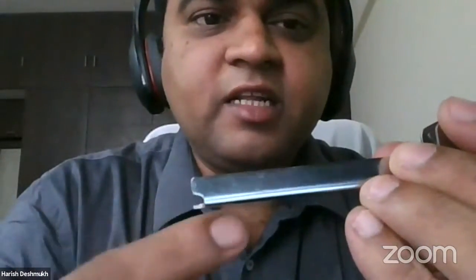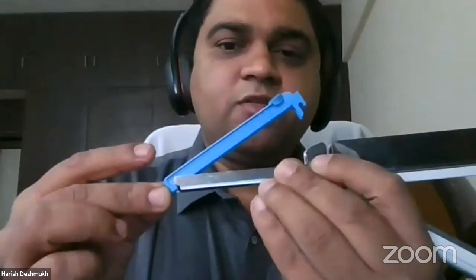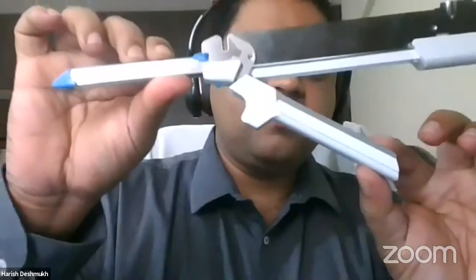If you see here, we have the grooves present, you can see the design here. Both the sides have the same design. In the Advant gun also we'll have the same thing in the reload, and in the gun also we'll have a similar design. So when we apply, just keep it at this angle into the cartridge and drop it down. During this time, your handle should be completely open.